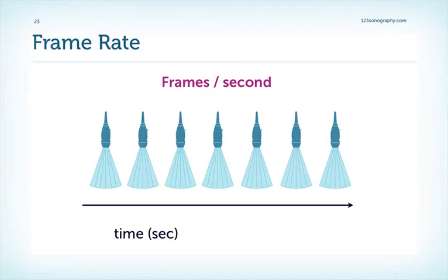Frame rate is defined as the number of images, or pictures, which are displayed within 1 second. Just to give you a better appreciation, in PAL television we have frame rates of 25 frames per second, while with HDTV we have frame rates of 60 frames per second.